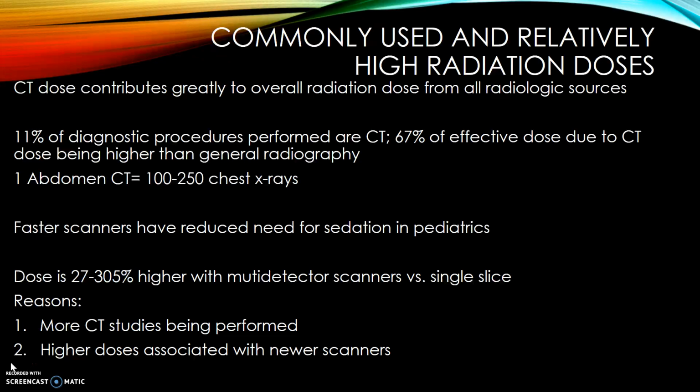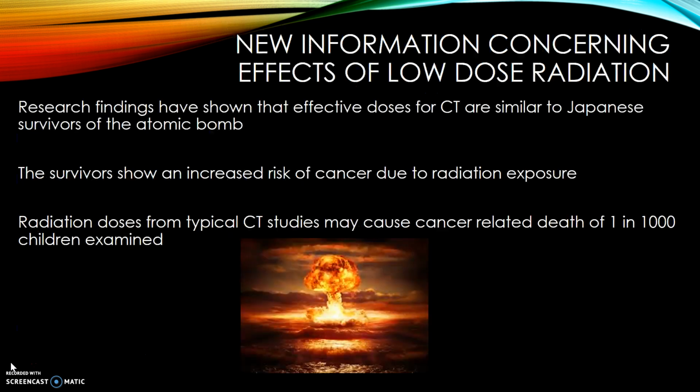Faster scanners have reduced the need for sedation in pediatrics, but dose is 27 to 305% higher with multi-detector scanners versus single slice scanners. The reason for this is because more CT studies are being performed, and there are higher doses associated with newer scanners.